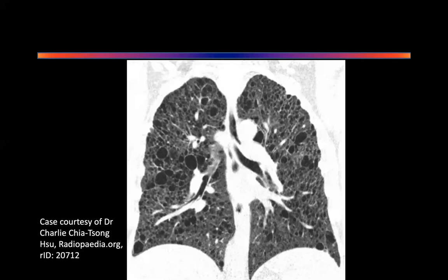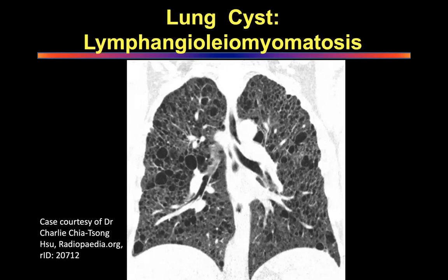But this X-ray, everybody look at it, is actually the classic example of lymphangioleiomyomatosis. It's okay, Biswarup, you don't have to make a diagnosis. You have to make multiple differential diagnoses. I'm very happy with what you told. Excellent, very well done, Biswarup. Lymphangioleiomyomatosis is called LAM, L-A-M. Sorry, this was the most difficult CT scan of the lot. Unfortunately, it came up first. But it's so classical that you should keep it in mind. I'm showing this for you to keep it in mind.